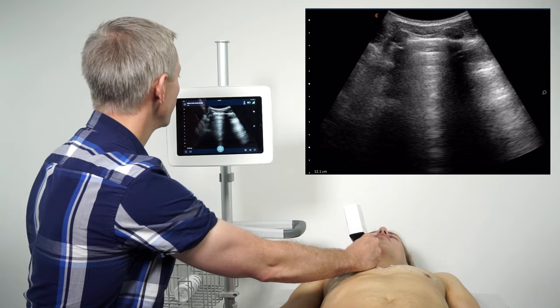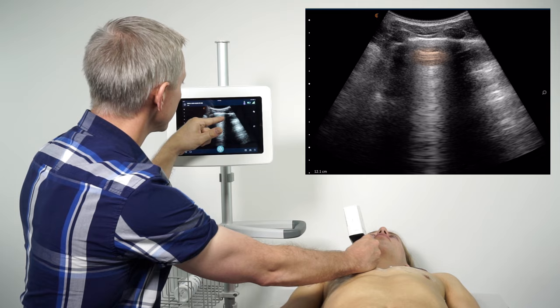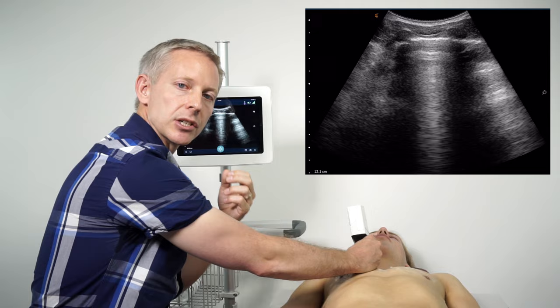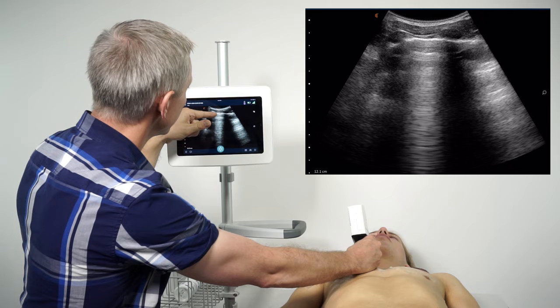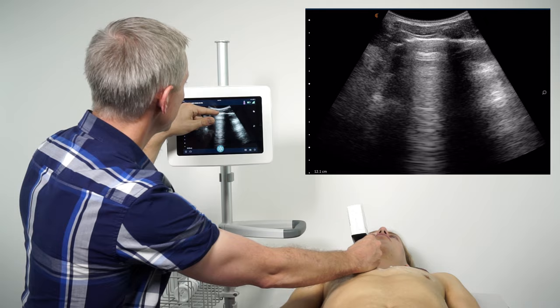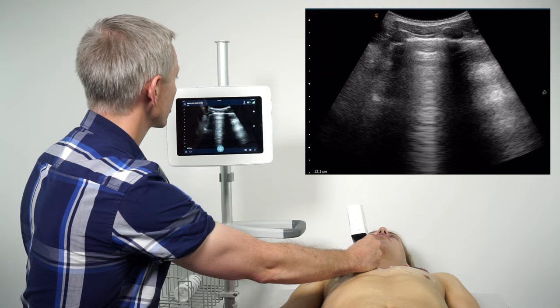The second important artifact I want to talk about are A-lines. These are horizontal artifacts coursing across the screen deep to the pleural line. A-lines are produced as a result of the hyper-reflective pleural line, which indicates that we're at a soft tissue-air interface. This soft tissue-air interface sets up a very hyper-reflective surface that causes all of our beam to be reflected back towards the transducer, meaning everything below the pleural line is actually artifact.